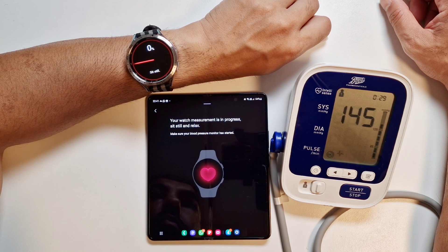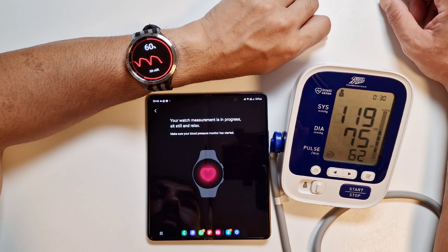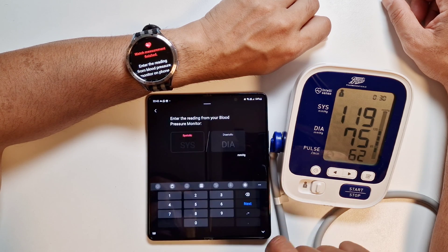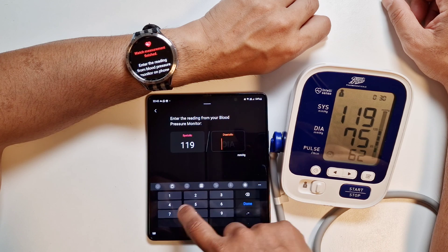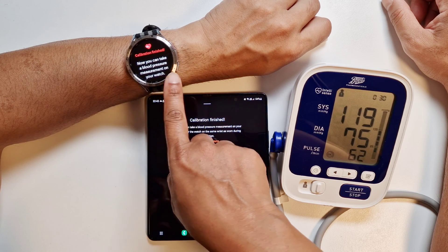The watch has started as well. The watch is prompting you and giving instructions not to move or talk and to sit still and relax while the reading is being done. The medical device is done and we're waiting for the watch. The watch is done — we've got the third measurement. We confirm yes we want to enter — it's 119 over 75. Done, and it's asking to confirm — confirm.